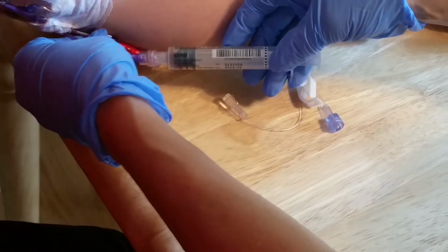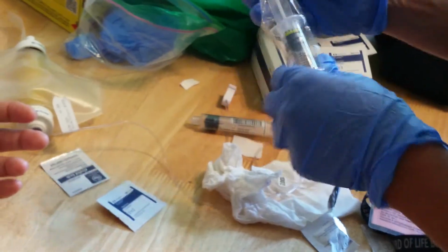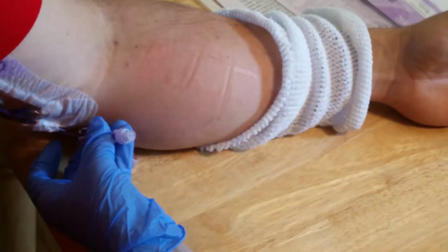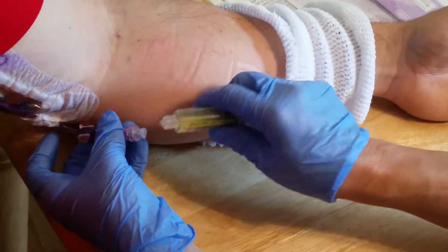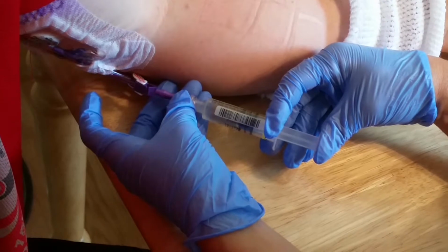Okay, and then I'm going to clamp it. Twist it off. Okay. And that's the saline. And then this is the heparin that'll keep the line open so that we don't get a clot in there. Do we need to wipe it down again or no? Always better to wipe it off each time. You can kind of push it with your pinky. I wonder if you'll taste the heparin.